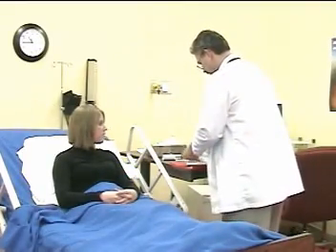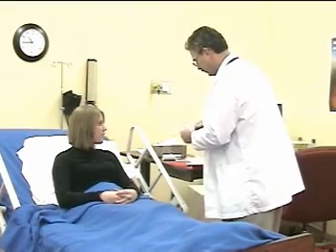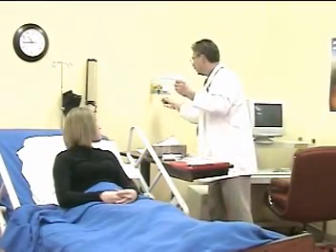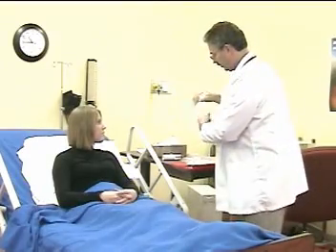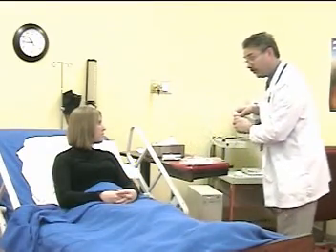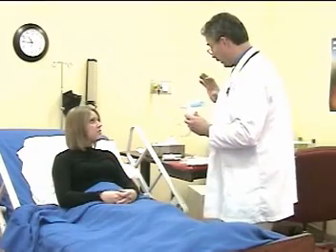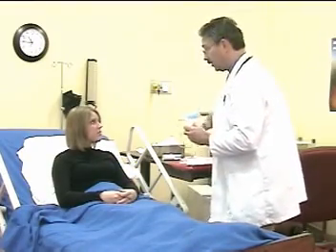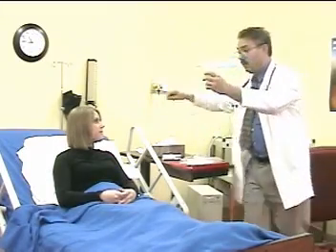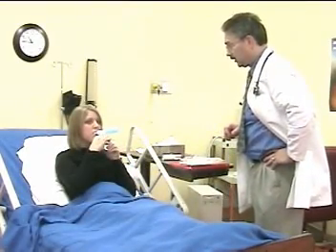The therapist coaches and encourages the patient while assembling the equipment. Are you ready? What I want you to do is place this in your mouth and just breathe gently in and out. Periodically I want you to take a little pause and then let it out — big breath in, pause, let it out. I'll tell you how to do that as it goes. Put the mouthpiece in your mouth and just breathe through your mouth.